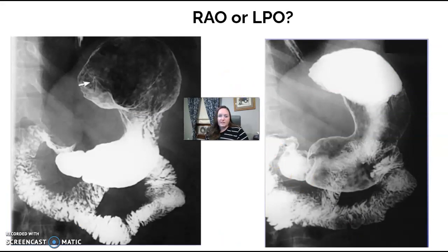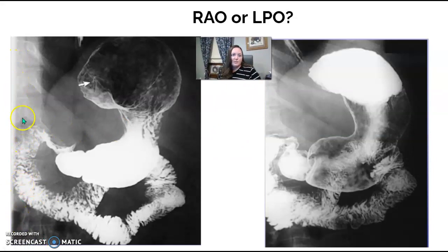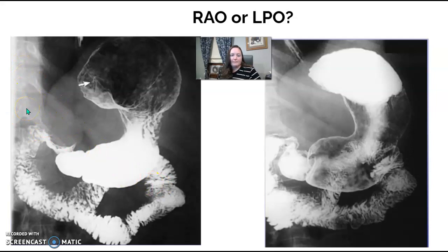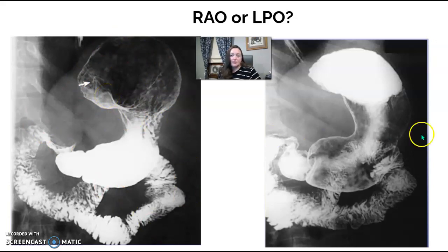Is this RAO or LPO? I can see a bit of the spine — it's kind of cut off — but I can see the elongation of the rib cage and the connection of the ribs to the vertebrae, so I know this is an oblique. I have air in the fundus, so the patient has to be in a prone oblique — my only option is RAO. For the next image: barium in the fundus — LPO.